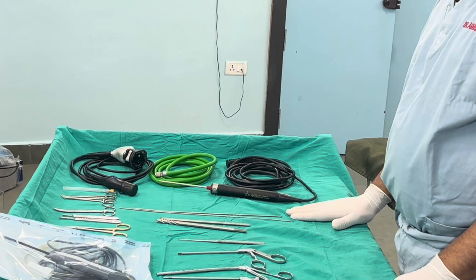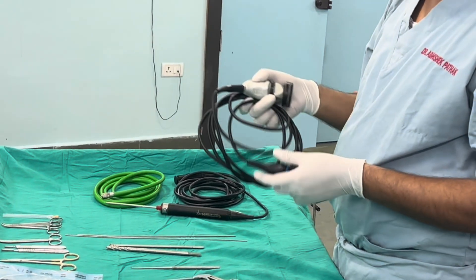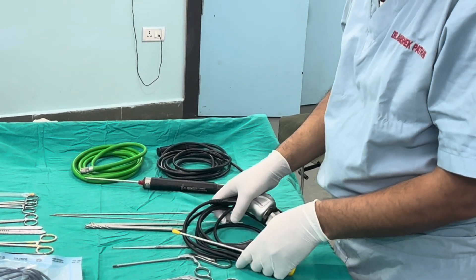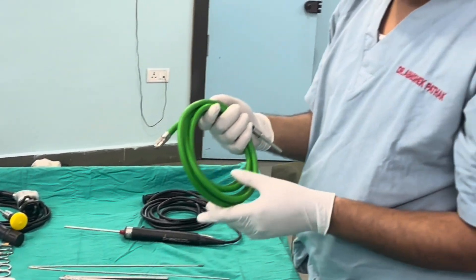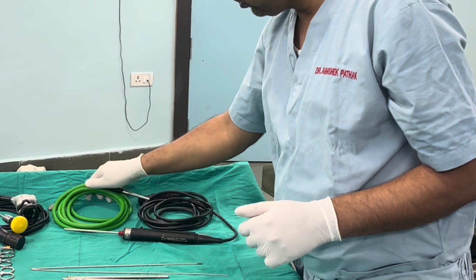The basic instruments needed for arthroscopy include the camera head with the cable, to which we fix the arthroscope. This is the arthroscope and this is the camera head and cable. This is the light cable, which connects on one side with the scope and on the other side with the LED light source.